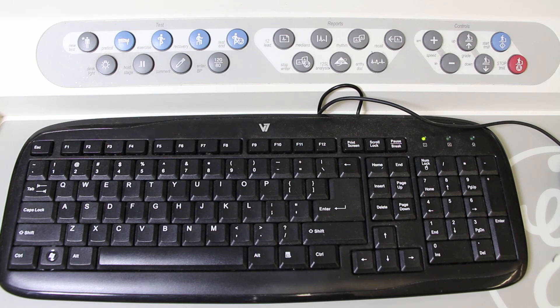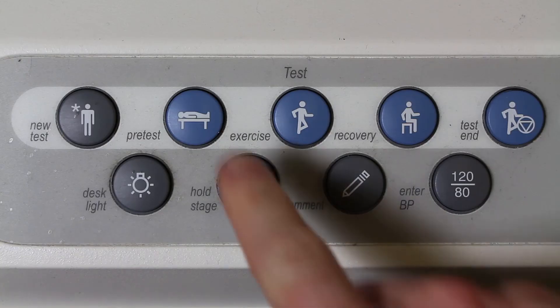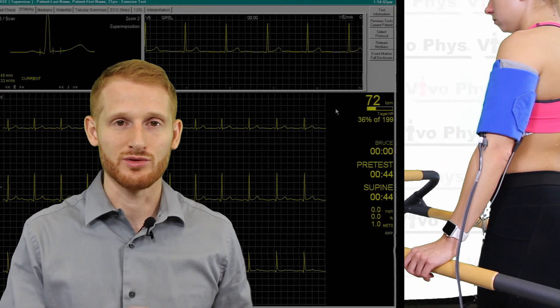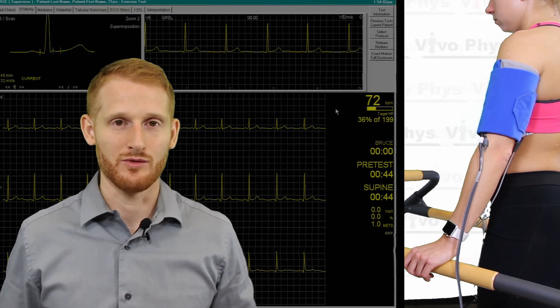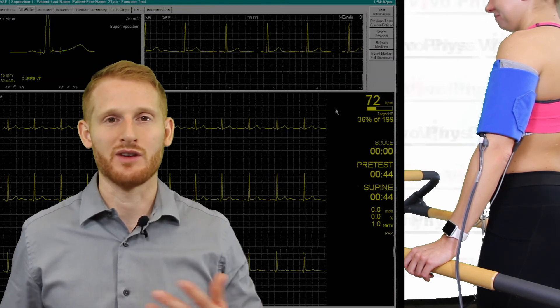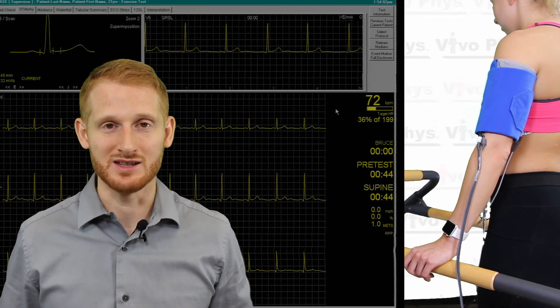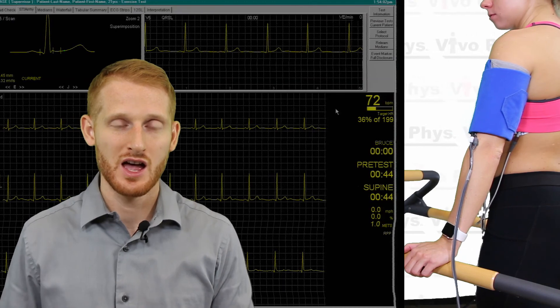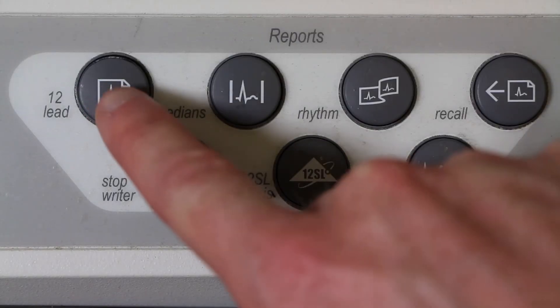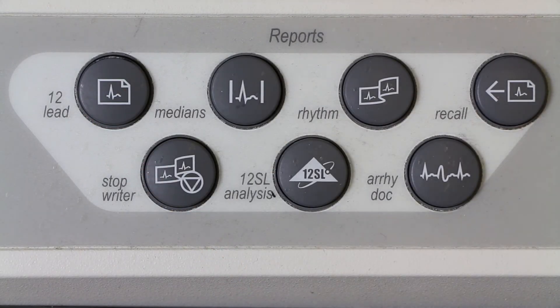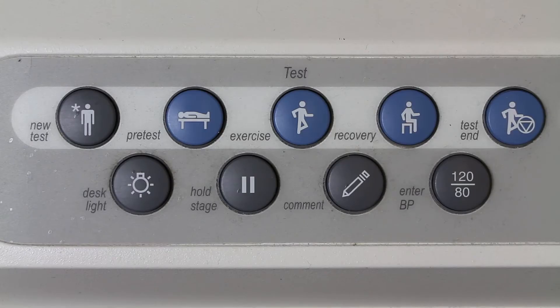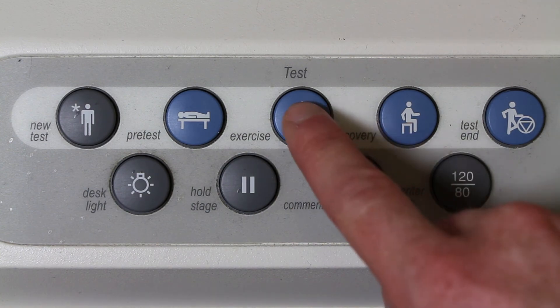If you go to the buttons above the keyboard, hit the pretest button. The pretest button is going to change the way the screen looks. You can hit the pretest button multiple times. It'll go through different phases of rest where you can record different things like hyperventilation and record what happens to their ECG during those different maneuvers. Most of the time, you're going to print a baseline ECG during that pretest phase just so you know what's happening at rest. Then you're going to hit the exercise button that's above the keyboard as well.